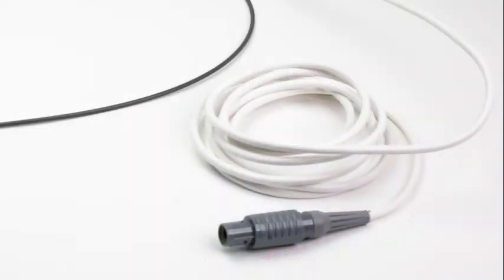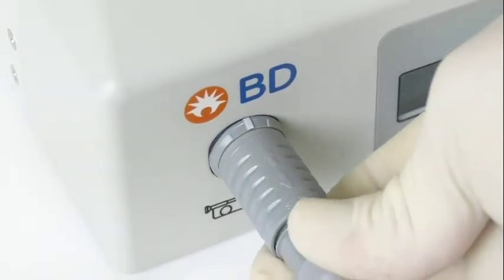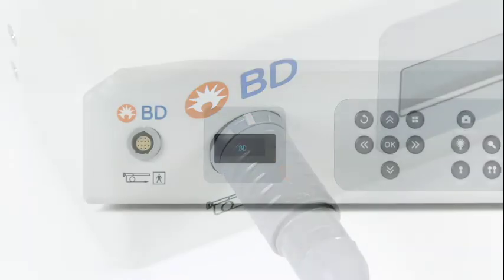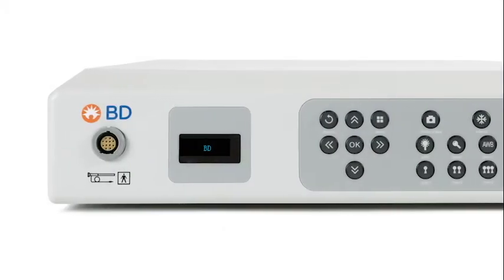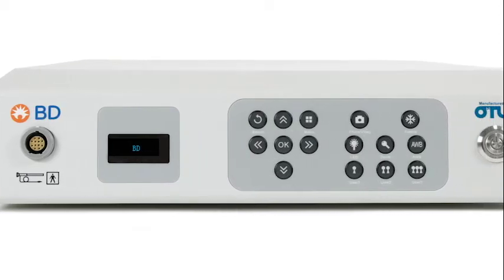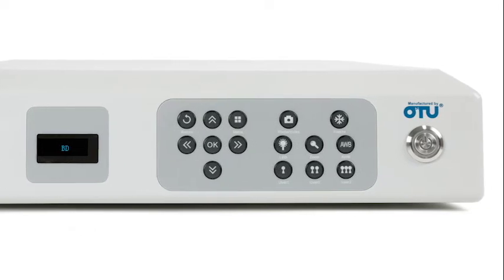At the end of the handle, there is a 2.8-meter cable that connects to the BD-APTRA image system. The end of this cable has a plug which should be lined up with the corresponding cable receptacle on the BD-APTRA image system. The BD-APTRA image system displays video images from the ureteroscope to a monitor or computer, which can then be viewed by the surgeon.